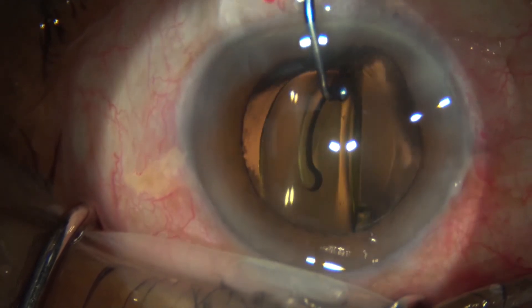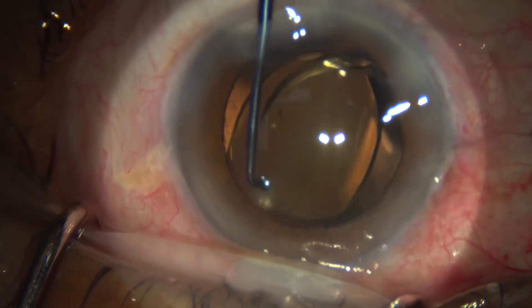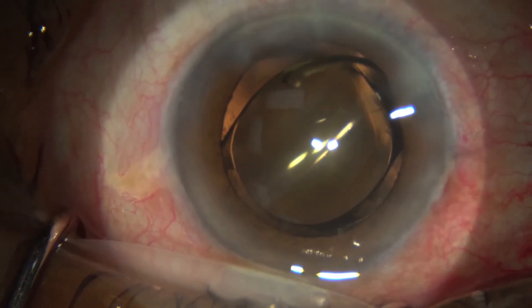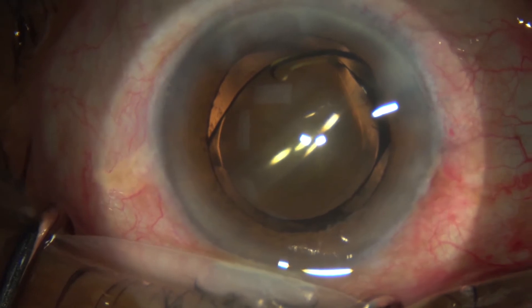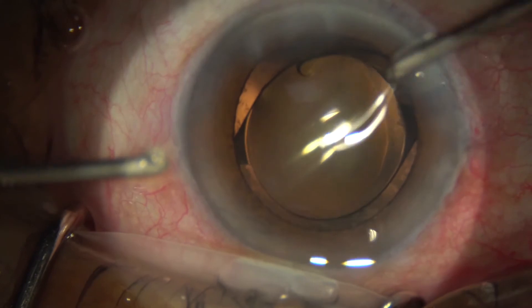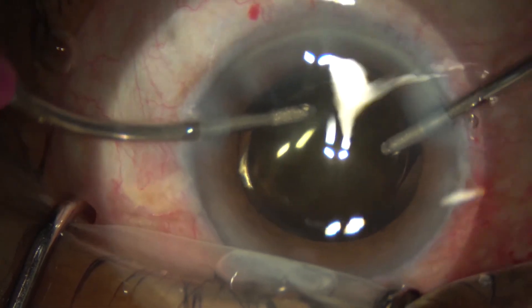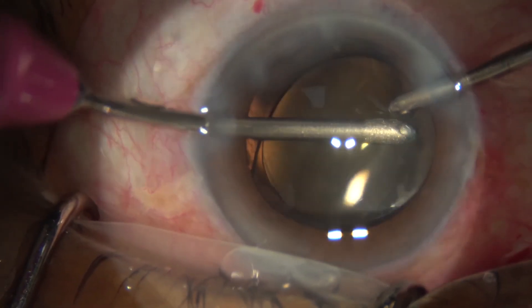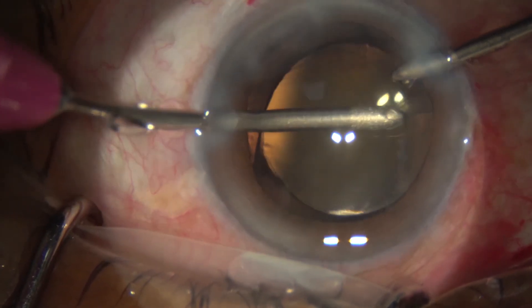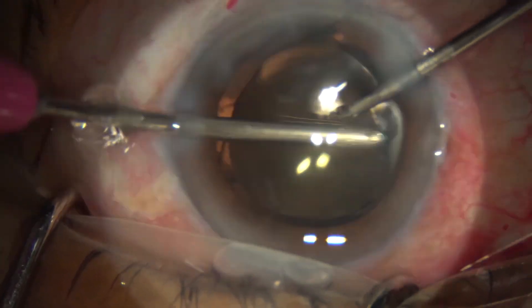As you can see, the lens is now sitting within the capsular bag and is slowly opening up to rest in place. It takes a little bit of time and manipulation to get the lens in the right position — patience and a bit of time means you'll be able to sort it out quite easily, so the patient's vision is as good as it can be after surgery.